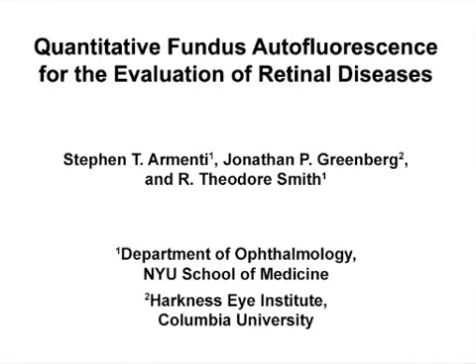The overall goal of quantitative autofluorescence, or qAF, is to evaluate the overall level of lipofuscin in the support cells of the retina, the retinal pigment epithelium, or RPE, in both healthy and diseased eyes. This technique can help answer key questions in retinal cell biology, such as how the health of the retinal pigment epithelium interacts with the development of age-related macular degeneration, or AMD.